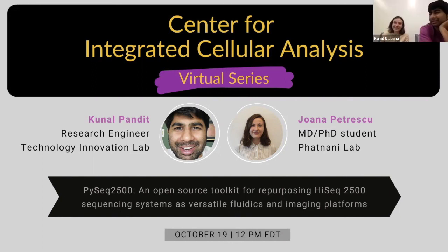Yeah, definitely. Yes, to all of this. That's a great question. We definitely, especially because we're using fresh frozen tissue, and postmortem tissue that is fresh frozen is also very fragile, see that after 6-8 rounds, we see some degradation in the tissue itself. And so we kept it below that number, but I also think there's some variability in the stability of the epitopes that you would have to optimize for new antibodies, and make sure that if you're using it in a later round, the signal is the same as if you were to use it in the first round.